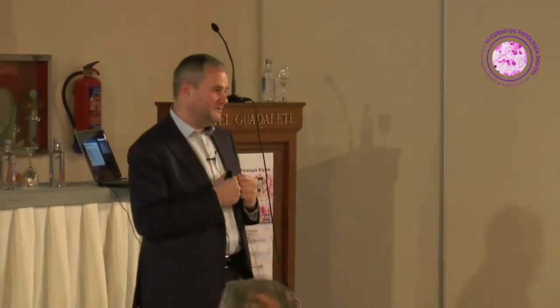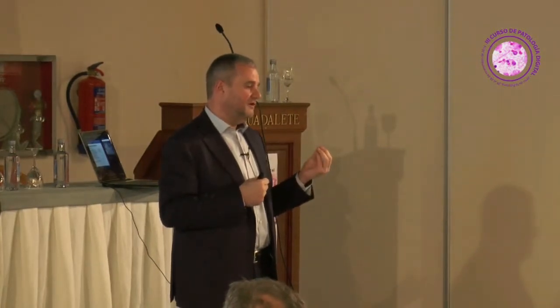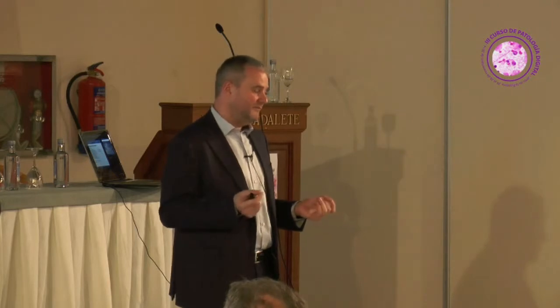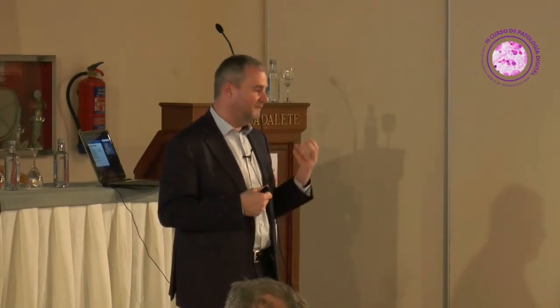So where I have the most doubt as to the standardization right now is when it comes to hormone receptors, if we insist on having Allred or H scores. In Scandinavia, for example, they're only looking at positive fraction. If you're only looking at positive fraction, you become less sensitive, but I don't know how much information you're losing there.